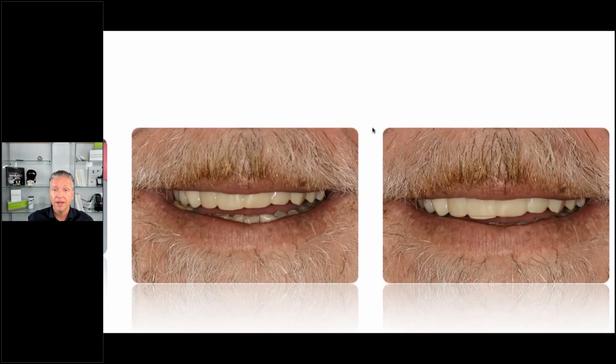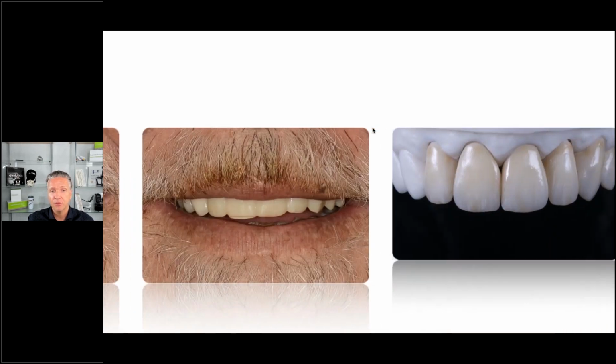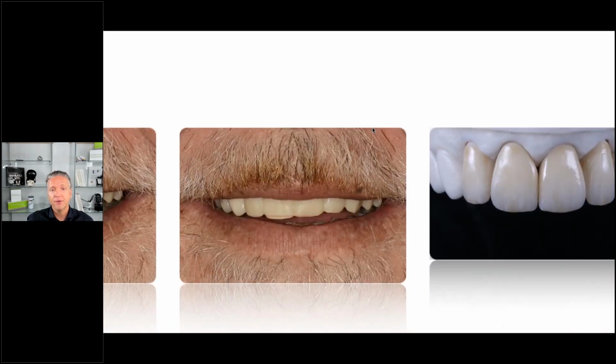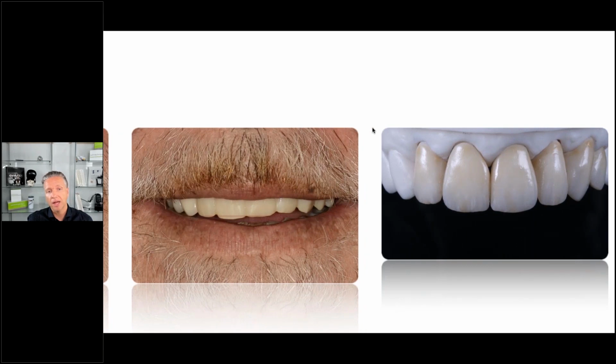We then fabricate a model. The doctor can use it with a stent for temporaries. We can make shells, whatever your customer is asking for. The nice thing here is what we usually do with the clinician, that's Dr. Perry in San Francisco. We're doing these cases a lot together, and he's really phenomenal in evaluating a smile and showing me exactly what has to be improved for the final.